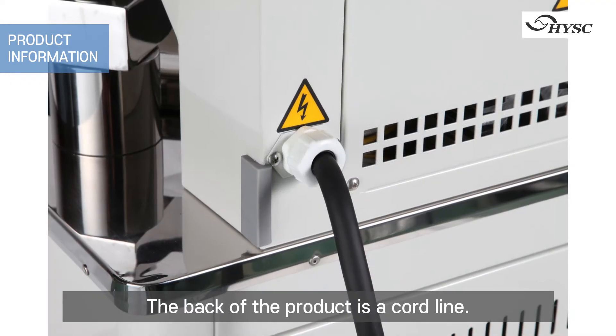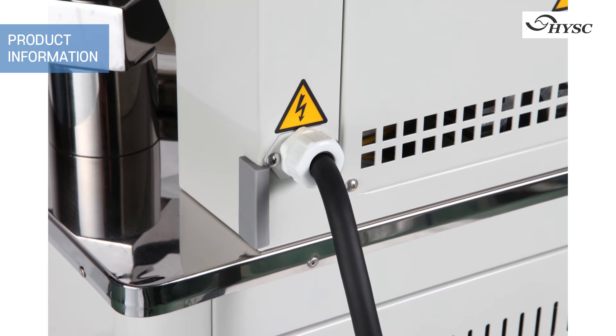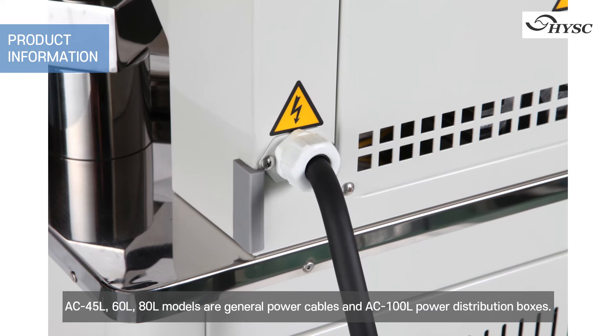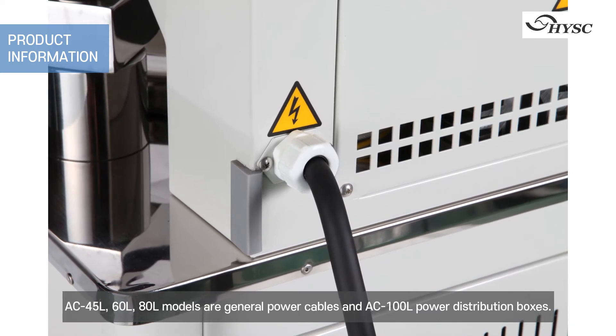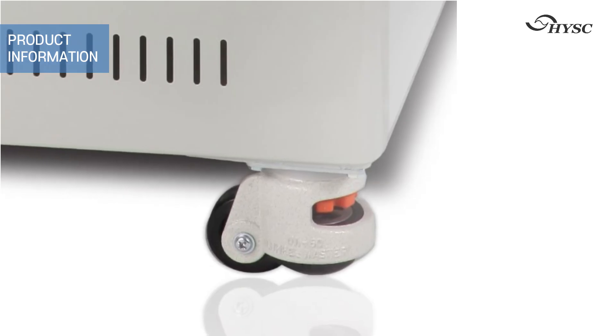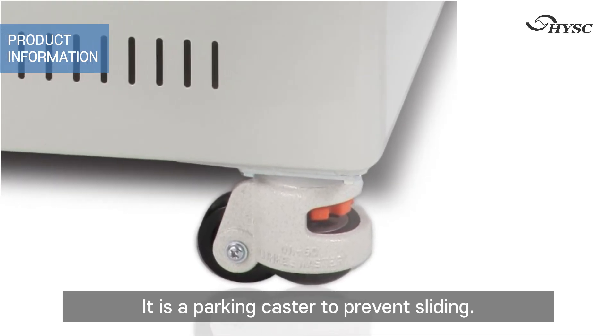The back of the product has a cord line. The AC 45, 60, and 80 liter models use general power cables, while the AC 100 liter model uses a power distribution box. There is a parking caster to prevent sliding.